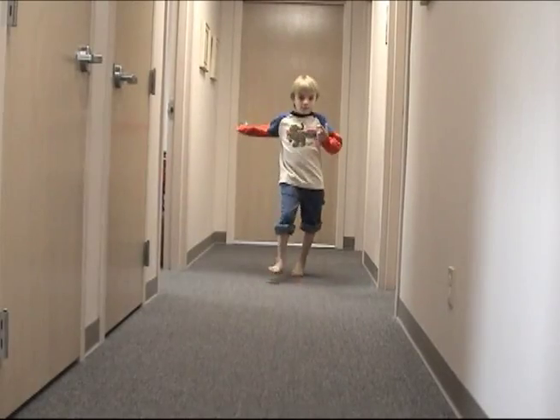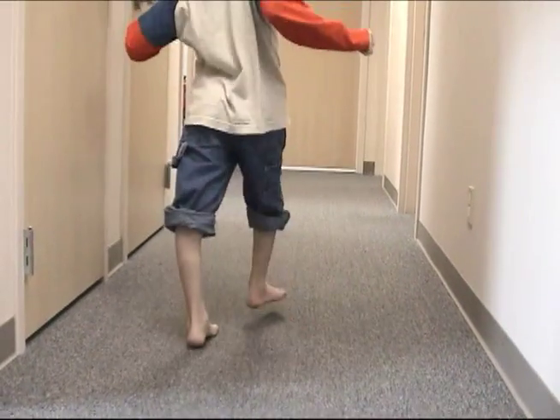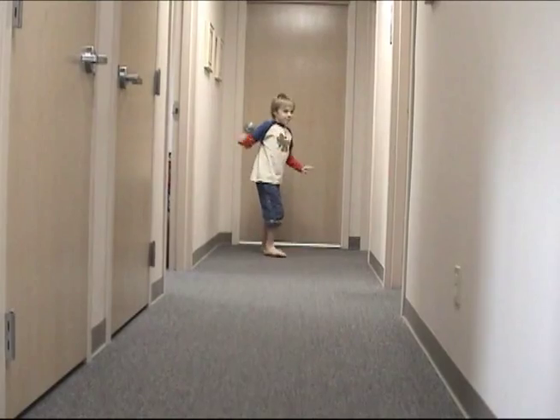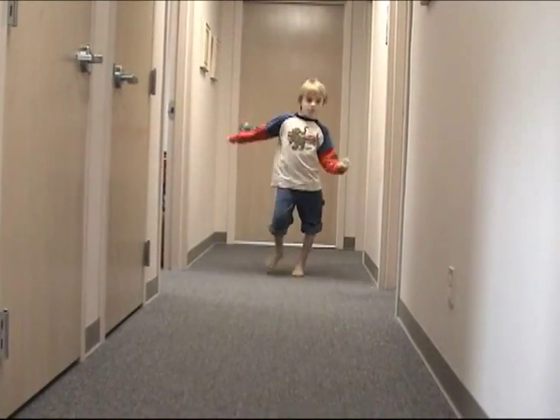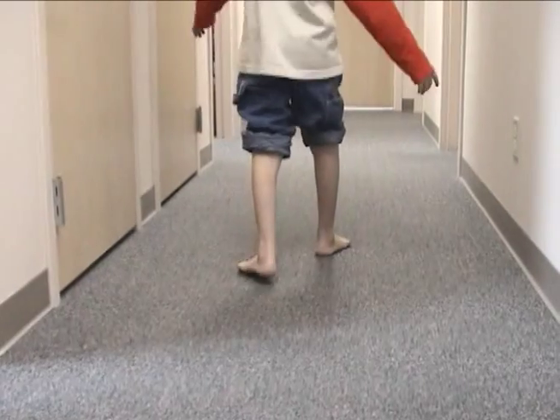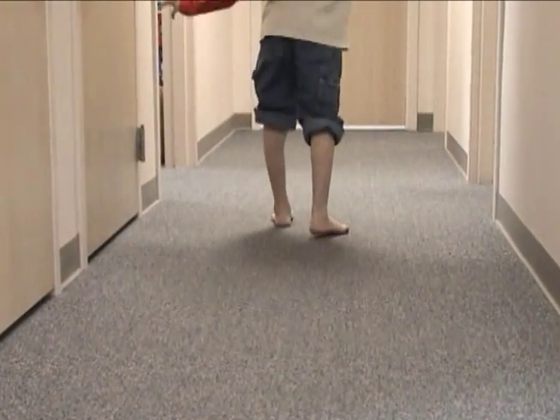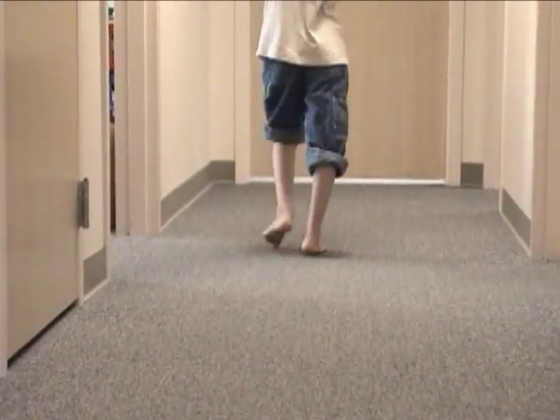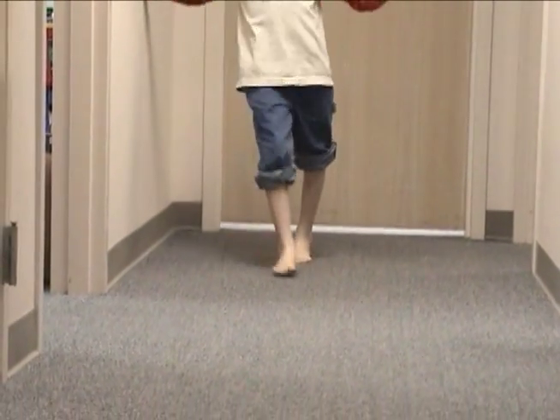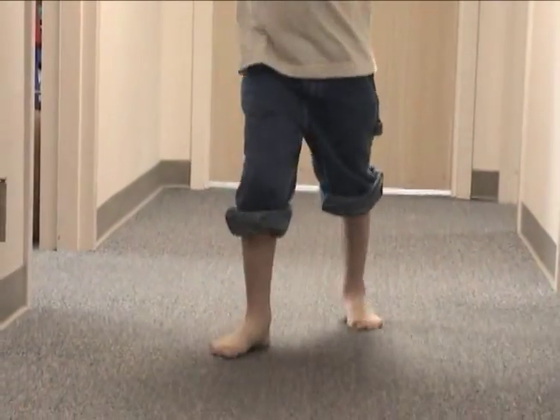As we watch Adam walk in the hall, we place him securely in our hyperextension patient category. Globally, it's very interesting to notice how much energy he generates using his shoulders. In the second gait segment, we see him walking at a much more controlled pace, and although his shoulder movement has been reduced, so has his velocity and his ability to get down the hall with certainty and confidence.